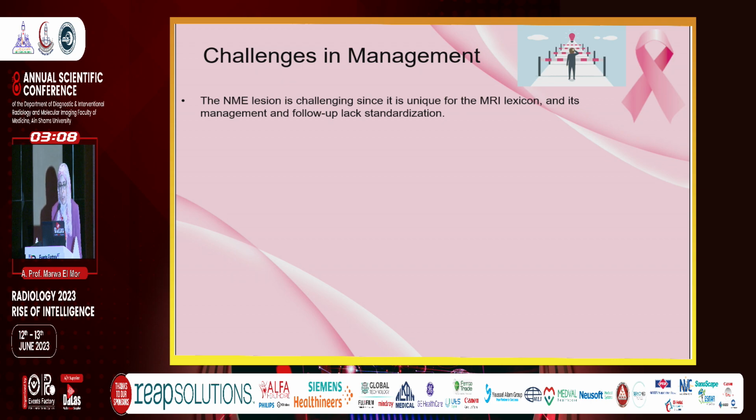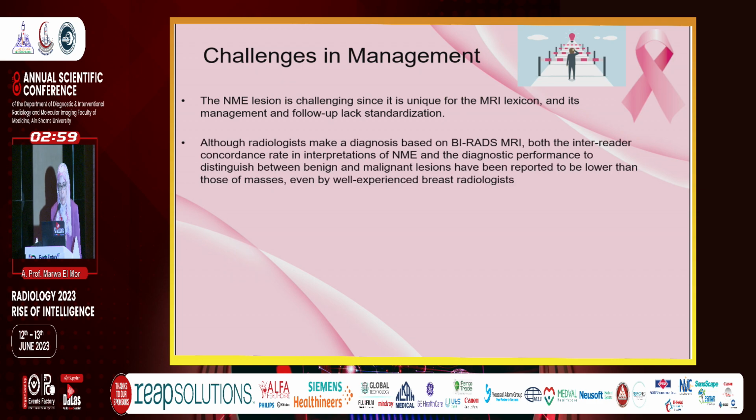The challenges in management of non-mass enhancement lesions: they are challenging since they are unique to the MRI lexicon, and their management and follow-up lack standardization. Although radiologists make a diagnosis based on the BI-RADS MRI, both the inter-reader concordance rate in interpretation of non-mass enhancement lesions and the diagnostic performance to distinguish between benign and malignant lesions have been reported to be lower than those of masses, even by well-experienced breast radiologists. There is substantial overlap in the morphologic and kinetic patterns of both benign and malignant lesions.